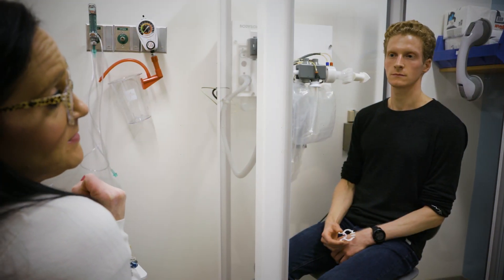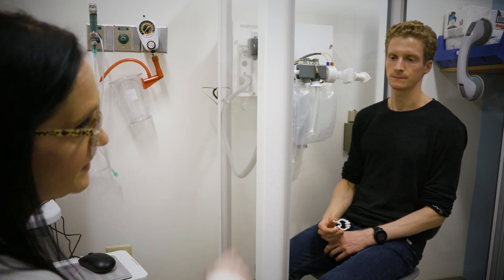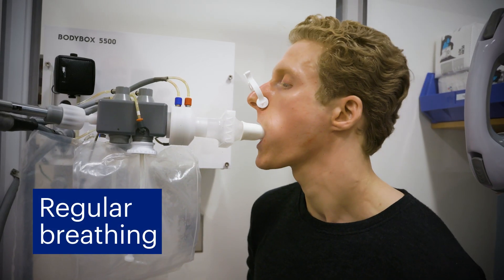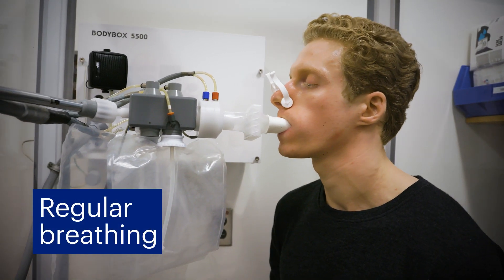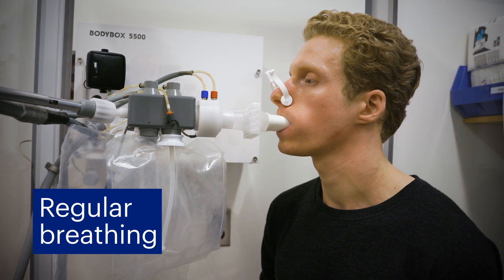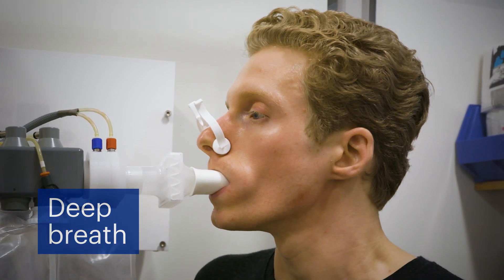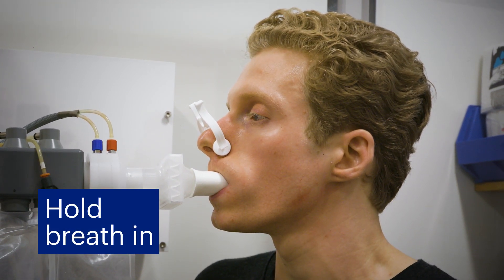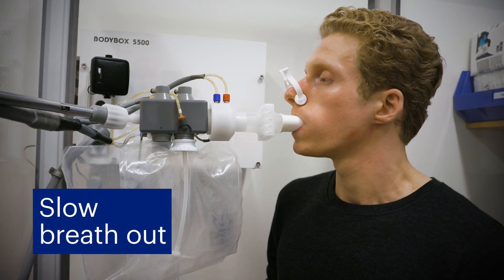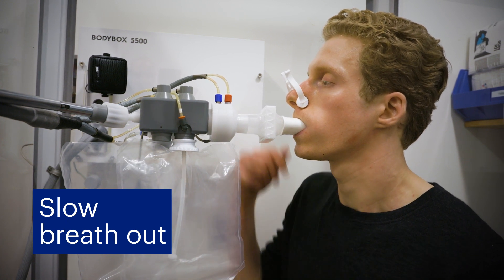The final test is called the diffusion test. This test measures the ability for gas from air to travel through your lungs and into your blood. You will start by breathing in and out normally. After a few breaths, you will need to take a deep breath in, filling your lungs completely. Hold your breath for around 10 seconds. Then, you will be asked to blow out all of the air out of your lungs. Continue breathing out until you're asked to stop.